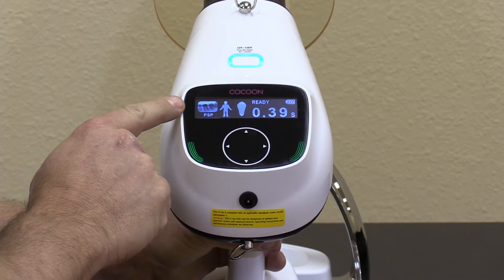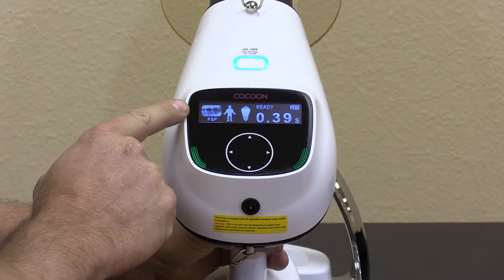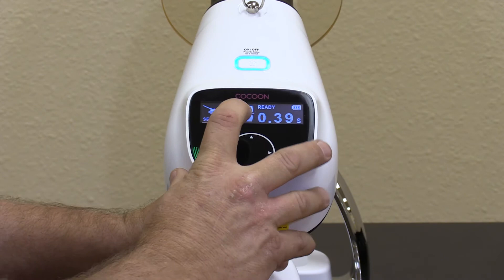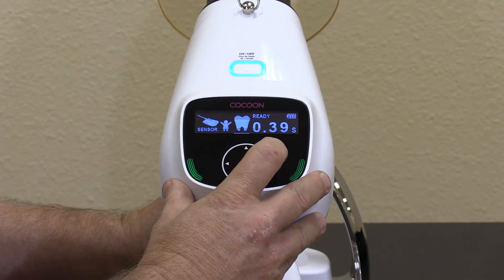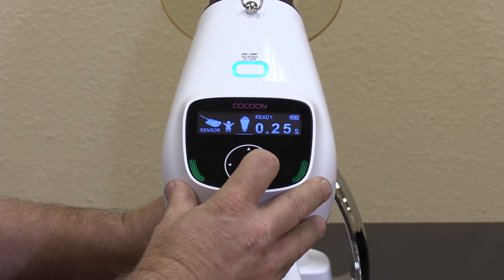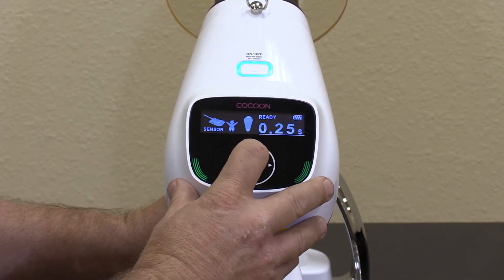Select the type of media that you'll be exposing, whether it's film, phosphor plates, or sensors. Simply select. You can select from child or adult exposure, tooth type, or a custom setting for your known exposure rates.